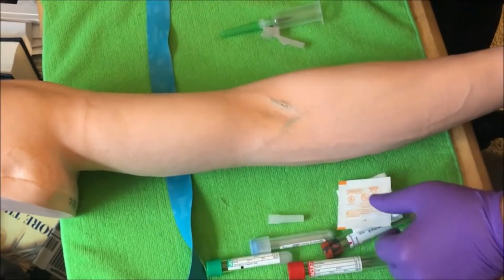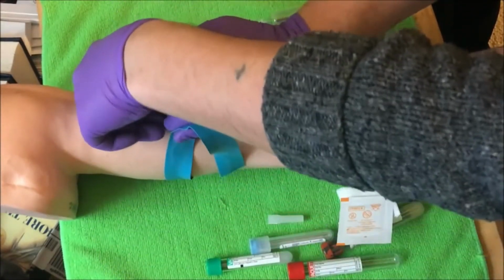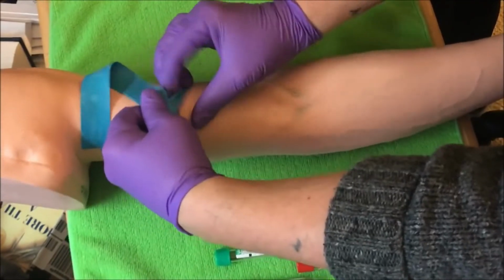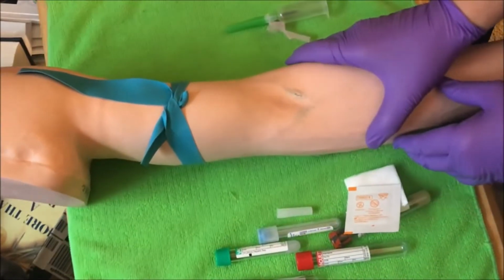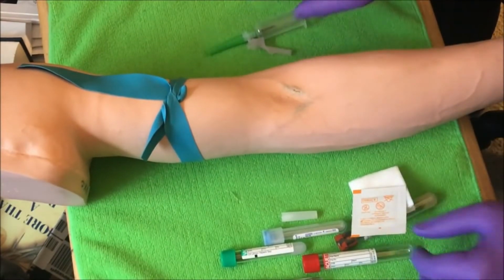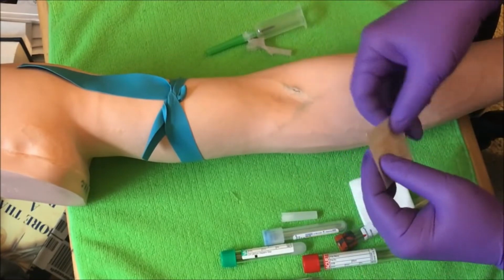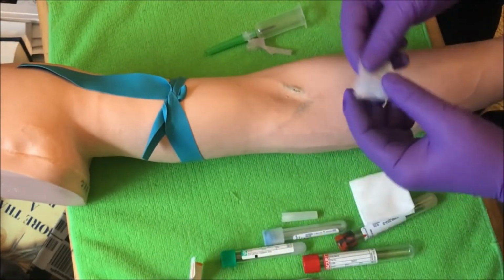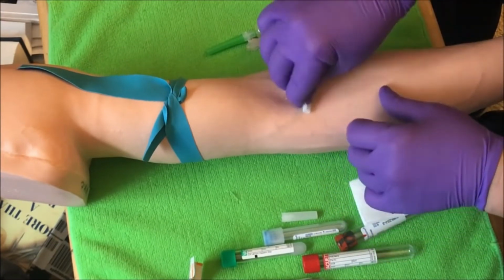Now let's talk about the alcohol, palpating the site. So here we go. I'm going to leave this on just so you can see the whole steps. Of course, it's going to be longer than 1 minute, but I'm basically showing you so that when we do it, you'll see it will not go over 1 minute. So again, I've located my vein 3 to 4 inches above the site. I'm going to tear open my alcohol. Now, some people like to take this and just start doing this.